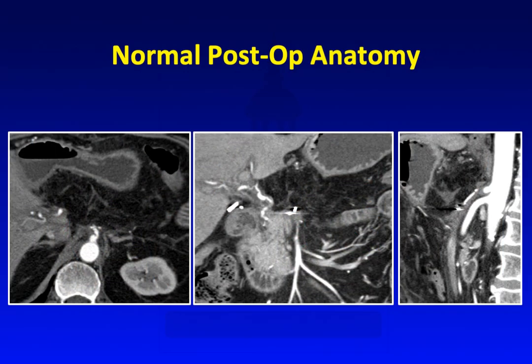This is normal post-op anatomy after an Appleby procedure. Due to the extensive surgery, most of the expected region of the pancreas is now filled with fat. You can see the fairly normal-looking pancreatic head, most of the surgical bed is filled with fat, and on the sagittal view you can see that the celiac artery has been ligated.